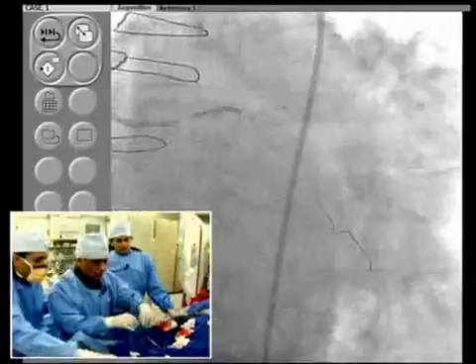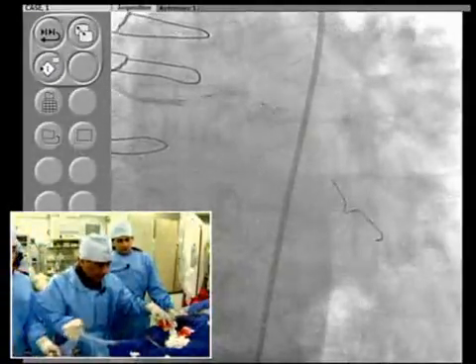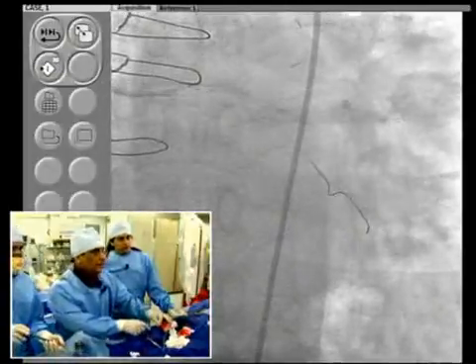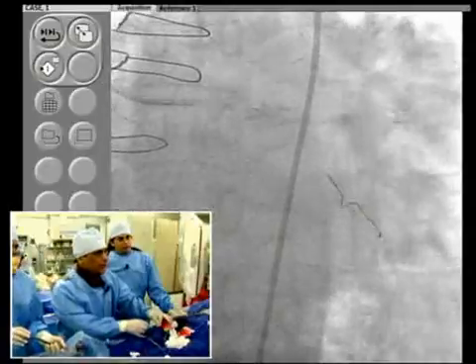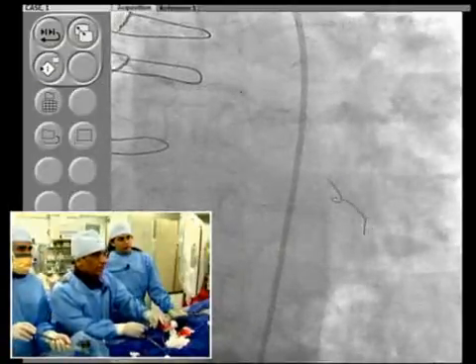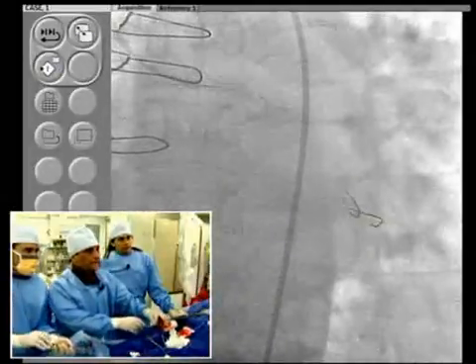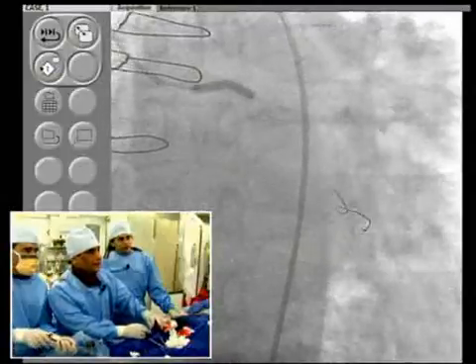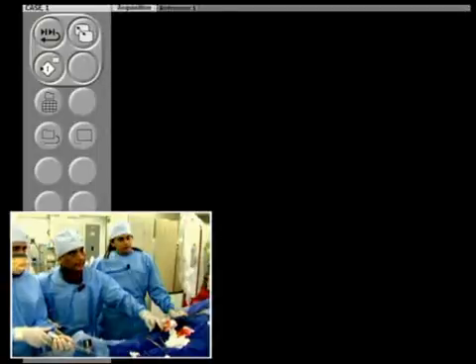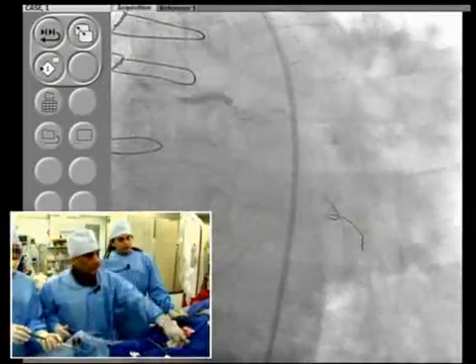And as I mentioned, in that second attempt in the total occlusion, rather than dissecting, as in this particular case, we did not dilate. Once you are dilated, it's a little issue, but you know there is a Pioneer catheter, which is based on the concept of your outback technique of the periphery, where you go through the subintimal space and then distally you confirm it and make a puncture into the distal vessel. So no problem from an insurance point of view bringing such patients back.